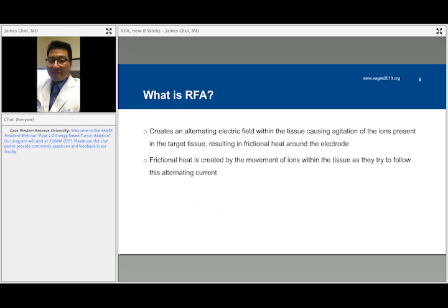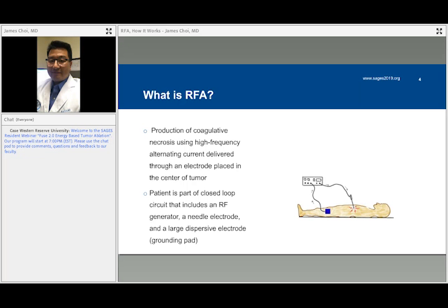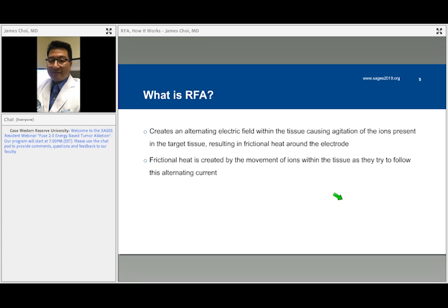So basically, this setup creates an alternating electrical field within the tissue. So this whole setup creates an alternating electrical field within the tissue that causes agitation of the ions present in the target tissue that surrounds the electrode, resulting in frictional heat around the electrode, okay? And the frictional heat is created by the movement of ions within the tissue as they try to follow this alternating current.